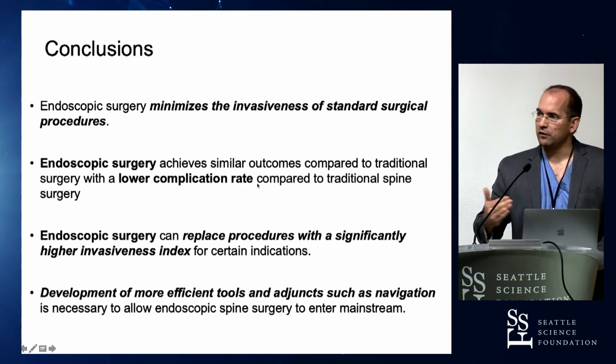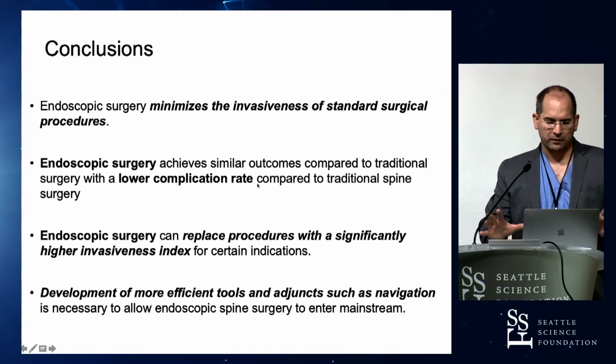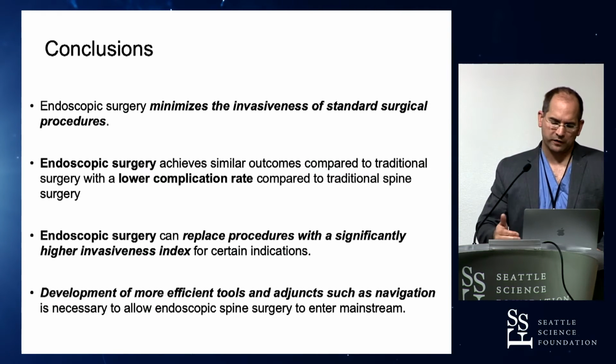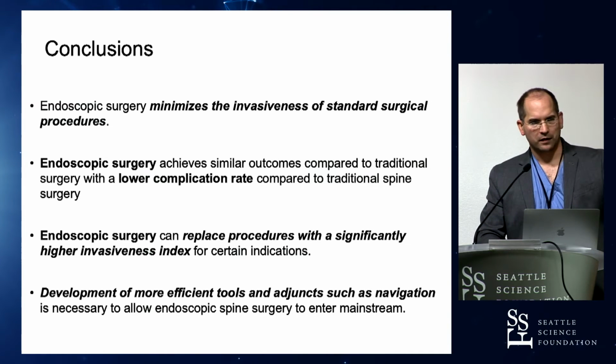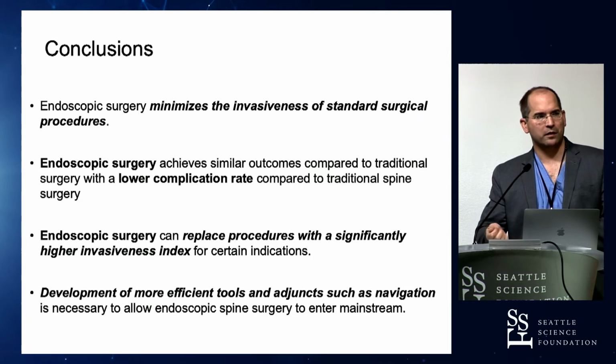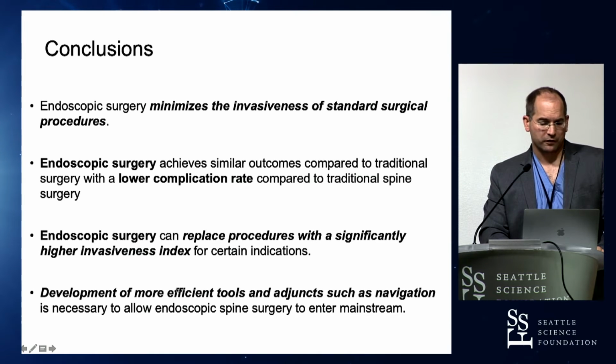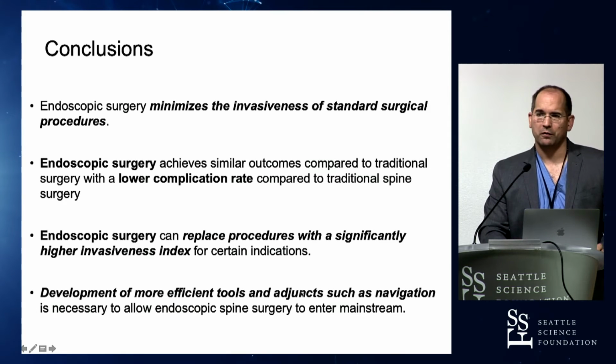And then the other thing is, I don't want to claim that it's any better than anything else. Everybody's a great surgeon. I learn so much every time I go to these meetings and talk to other surgeons. There's tremendous talent everywhere. But I think we can achieve a very similar outcome with this procedure compared with traditional surgery. Where it really shines is that we can decrease the invasiveness. And again, we need other technologies; it makes a big difference. Like Eric told us, you don't have to dig around and try often. You can be very precise and very targeted. But this field is very young, and we are still working on making the tools more efficient. We need adjuncts like navigation, robotic systems, and augmented reality, which are going to come in the next couple of years and will significantly enhance and ease the learning curve.